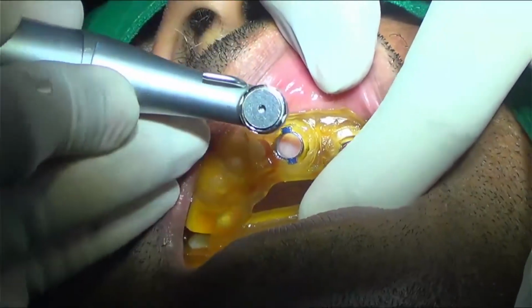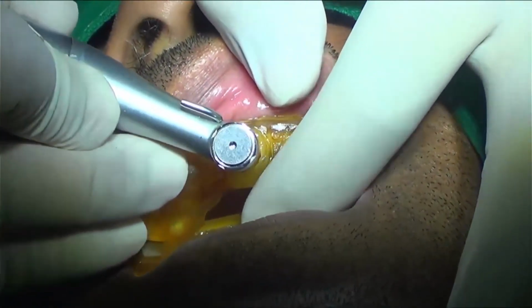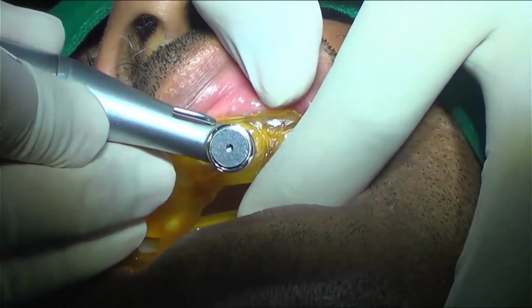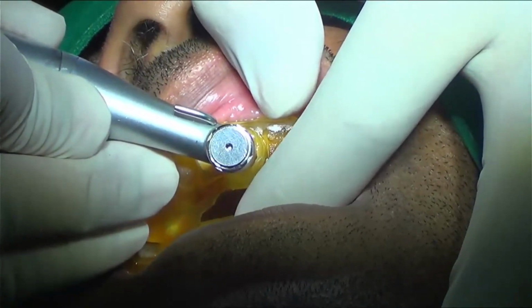First, just see how I am taking it inside. I take it in, and then I start my drill.